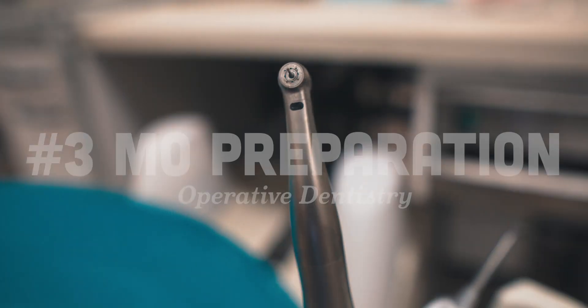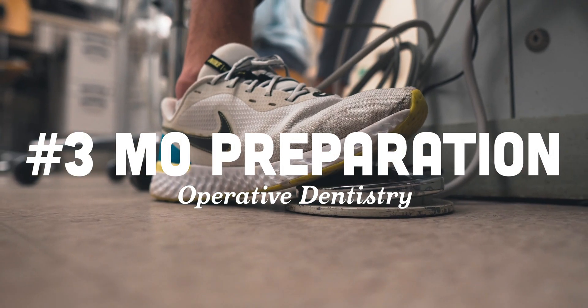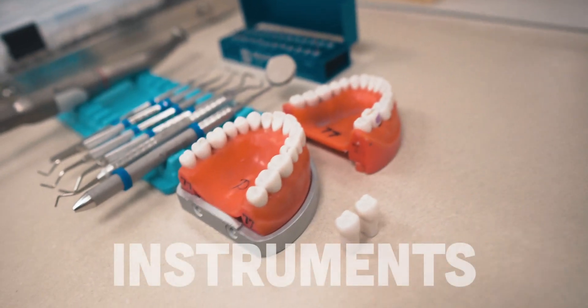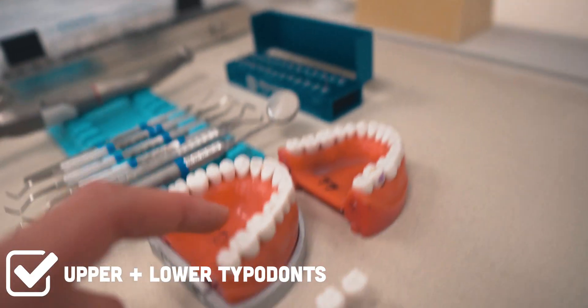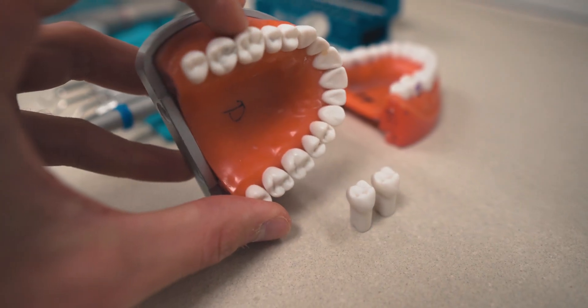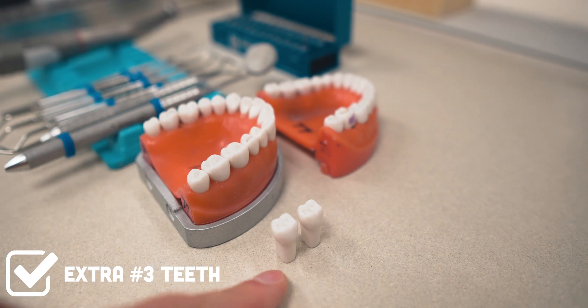I'm in lab and I'm going to be cutting a number three. We have a practical at the end of this semester to cut this prep — it's a makeup prep from a practical that got canceled. Here is your basic list of items: we've got typodonts. I don't have a metal base for this one so I'll just use one typodont, loaded up with a new number three right there. I've got a couple extra number threes just in case you mess up.